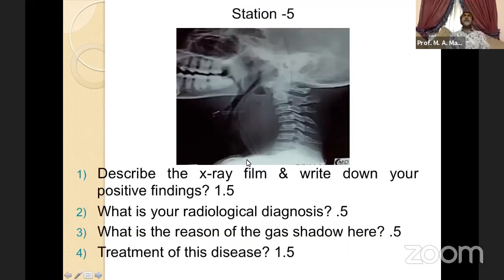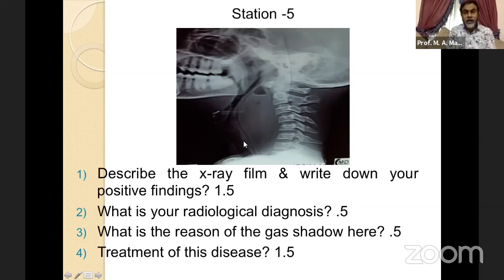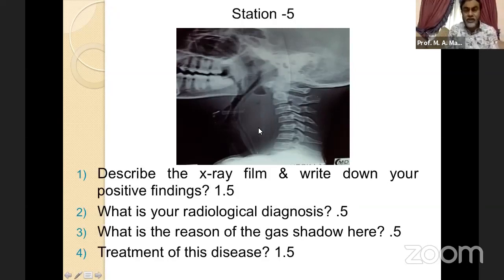This is a classical X-ray for OSPE: X-ray soft tissue neck, lateral view. The four key points are: number one, increased prevertebral soft tissue shadow; number two, the air column is pushed forwards; number three, the normal cervical vertebral column convexity is reversed — showing concavity forwards; number four, air and fluid level in the soft tissue area. My diagnosis: acute retropharyngeal abscess. This is a very classical X-ray for the exam.